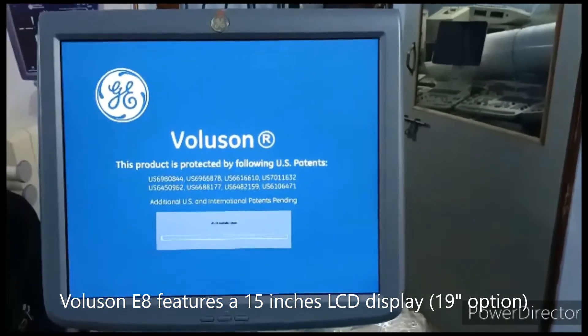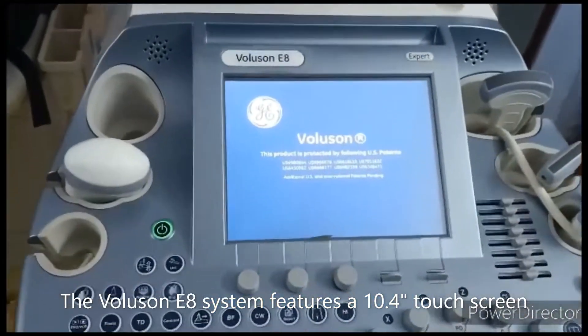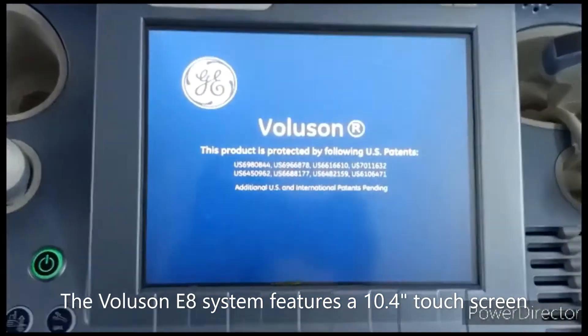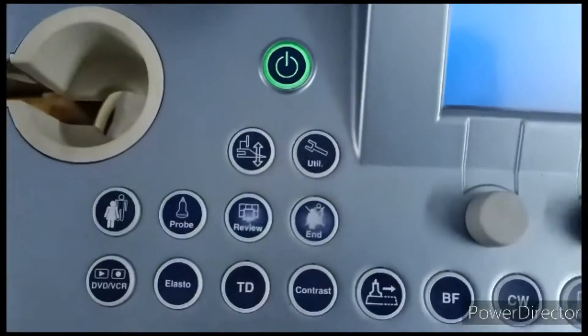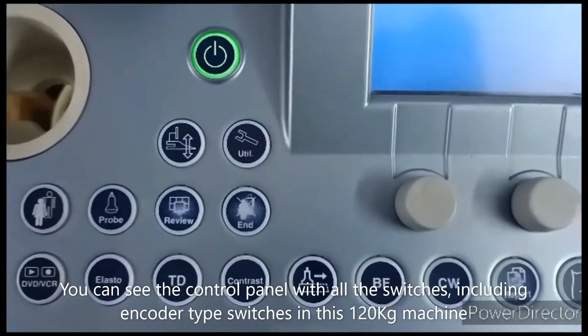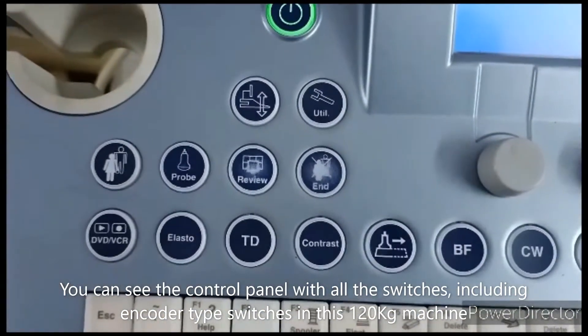This machine was launched in 2006. As you can see, the touchscreen is 10.4 inches, and this machine weighs 120 kg. You can see the control panel — control switches are available on it.